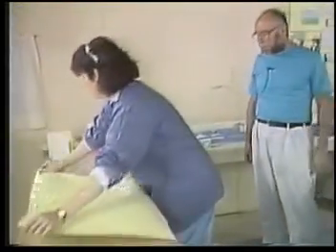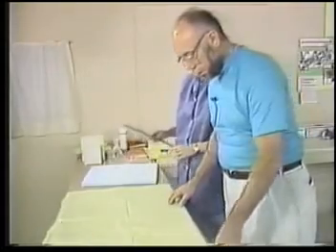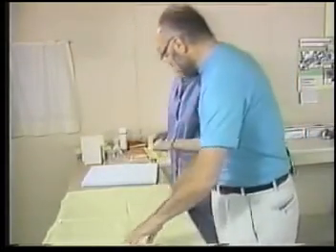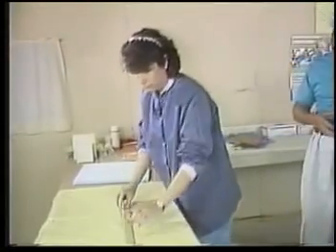A tough, durable polyethylene trash bag can be used for the molding process. Light-colored trash bags are preferable because they allow you to view the foaming process and locate any trapped air pockets. Use a large 30-gallon bag when molding an insert for an adult.